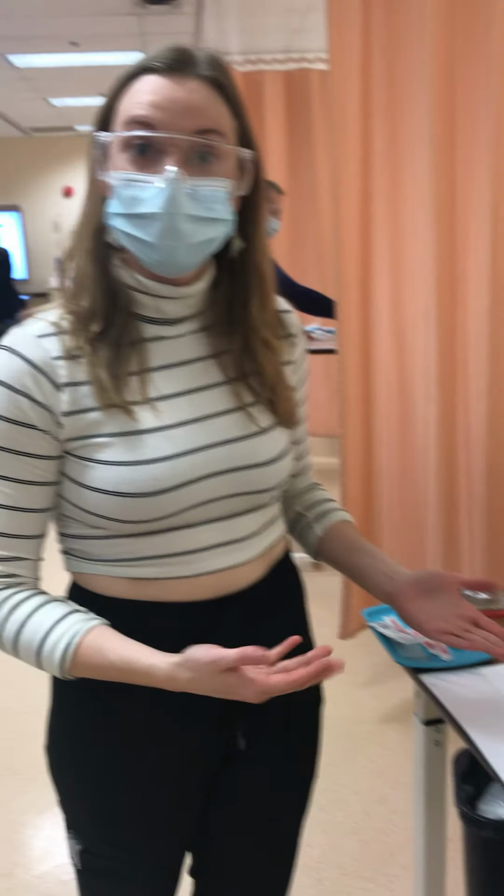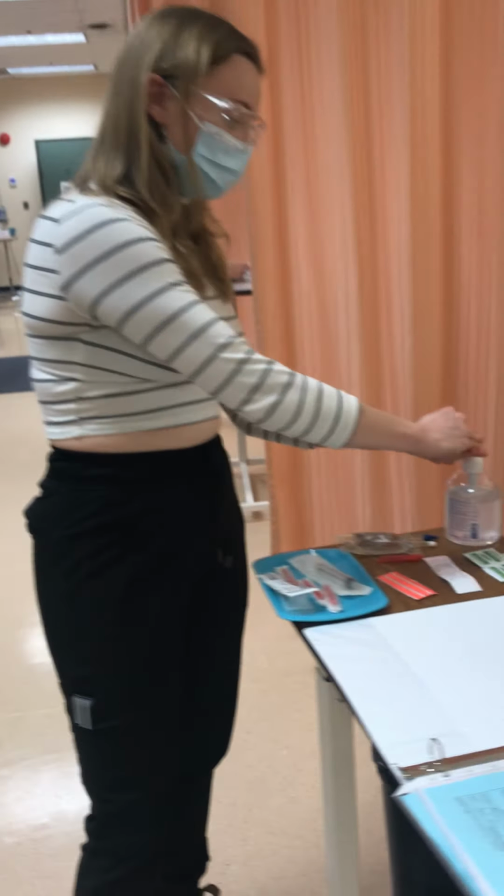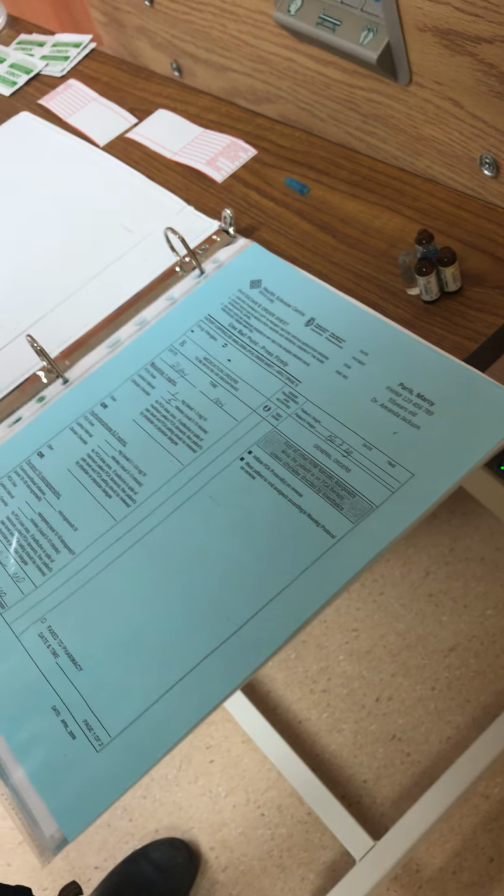O'Hara. I'm a student nurse and I'm going to be demonstrating how to administer PCA morphine. I'm going to quickly perform hand hygiene and begin. So the first thing we're going to look at is the physician's order sheet.